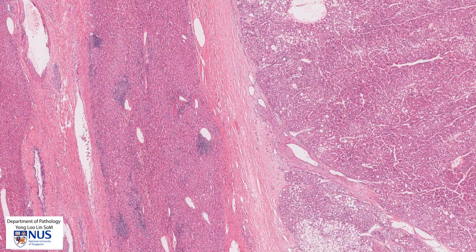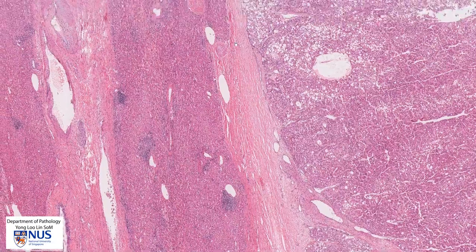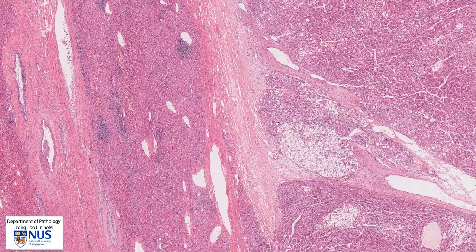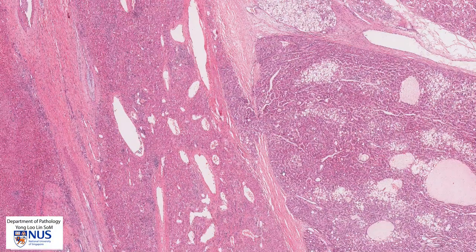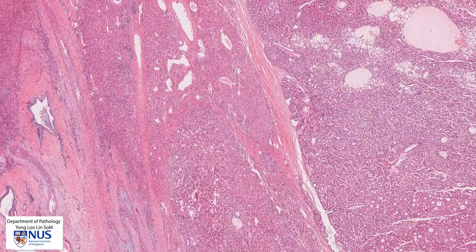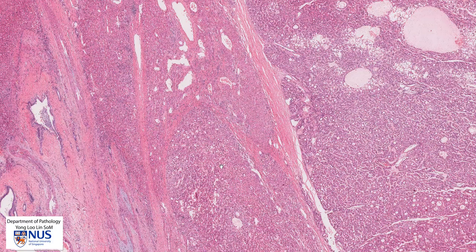Here is where the tumor starts. In this area, there is a fibrous capsule that separates the tumor from the non-neoplastic liver. However, if we follow this tumor downwards, we can see that the tumor is no longer delineated from the normal liver by a capsule. Over here, this is tumor, this is normal liver, and there is no capsule here. So some HCCs may actually have a partial fibrous capsule.